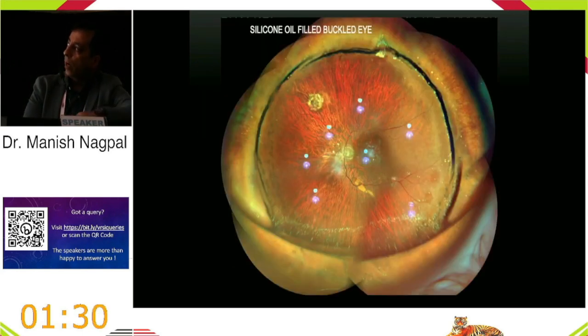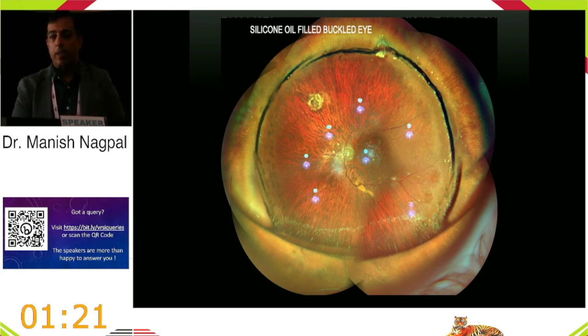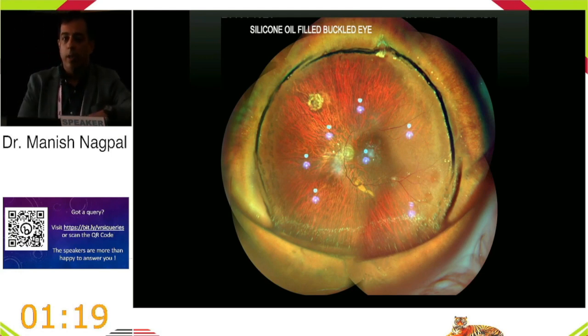This is an oil-filled eye with a buckle done post-operatively, and as close to a natural image as possible. So these are all the different ways that you can use this whole technology multimodally. And I feel, from the images I see, and I've seen the evolution of the SLO from the earliest HRA Heidelbergs that we used to have in the early 2000s to now, these are just brilliant as compared to what we are used to with the white light-based images.